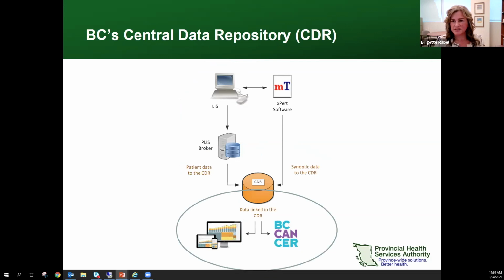The CDR then can be mined for a variety of different reports, as I will show you. Also, mTuitive created a feed that sends CDR data directly to BC's tumor registry. This feed is set up to run automatically on a bi-weekly schedule.